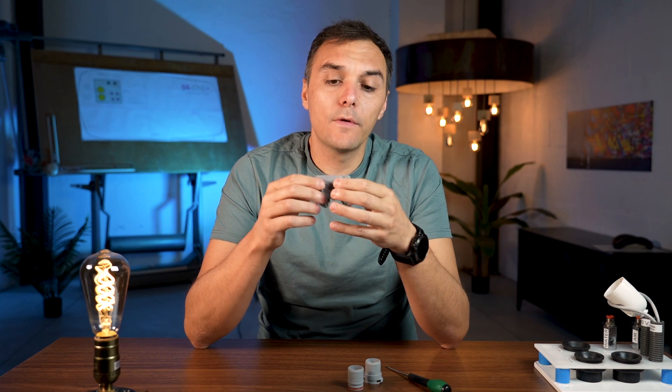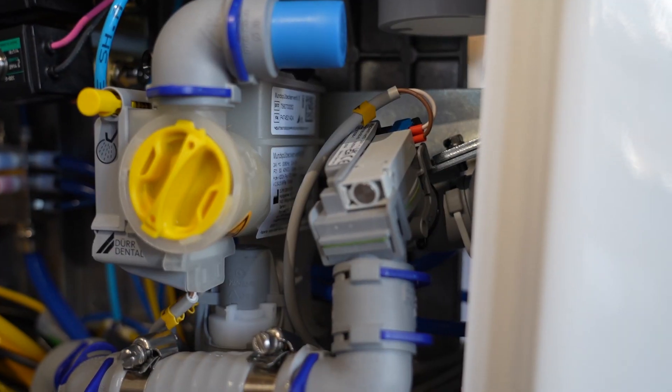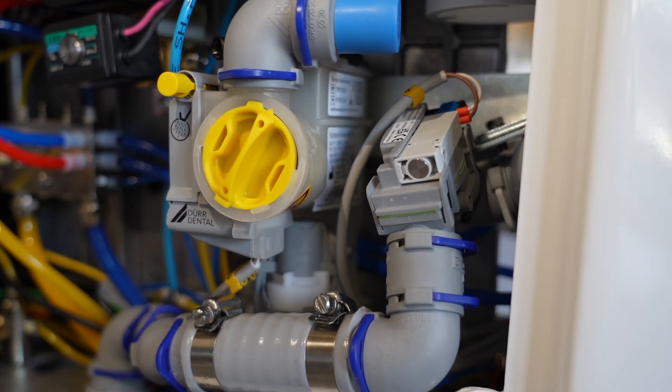The second purpose of this valve is to close the suction tube in a single dental chair when combined with the dual spittum valve. The dual spittum valve is the one that allows you to separate the suction from the basin and the suction for the cannula.